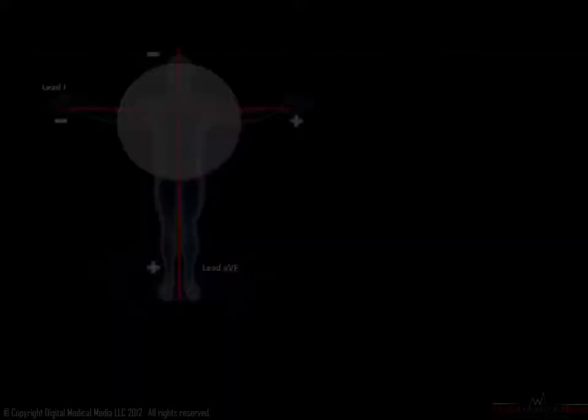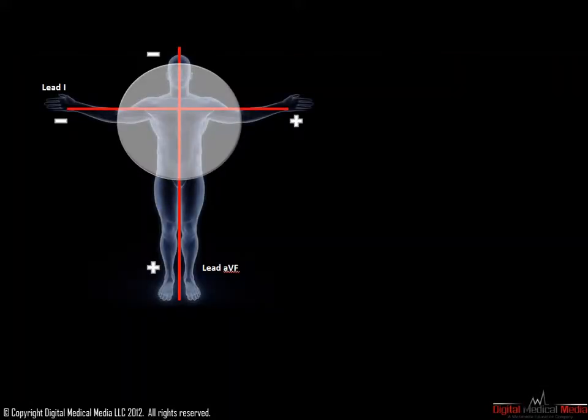So far we have discussed the concept of the cardiac axis in the frontal plane. By the frontal plane, remember, we are talking about transecting the body from head to toe, splitting the front half from the back half. Leads 1, 2, 3, AVR, AVL, and AVF all transect the body's electrical behavior in this fashion.